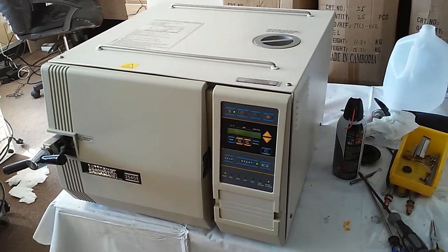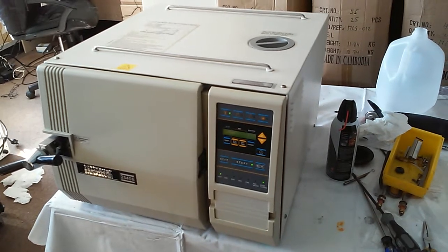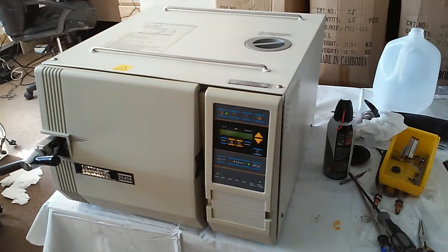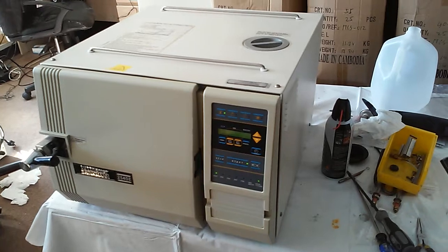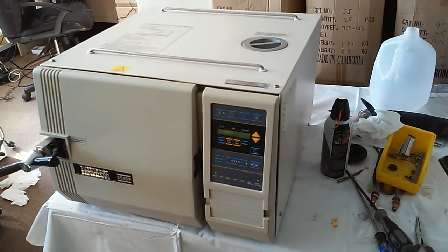For this digital automatic machine, normally if you get a problem, it will show you the error code — like low water, low pressure, low or high temperature, whatever. It will give an error code. From the error code, we can find the reason and know what the problem is.